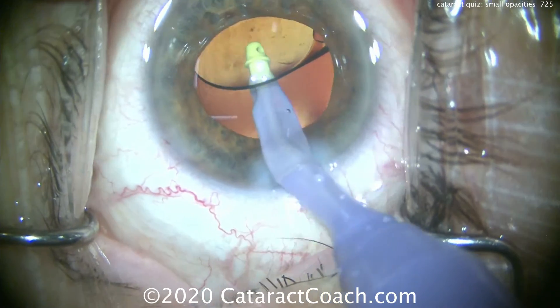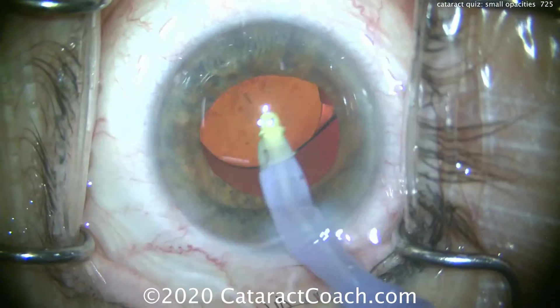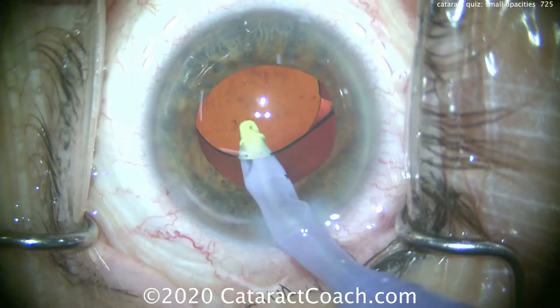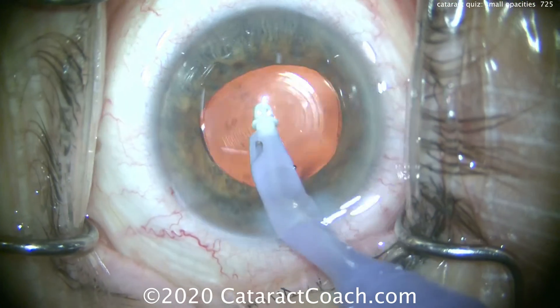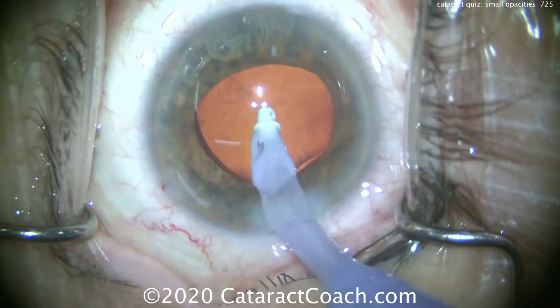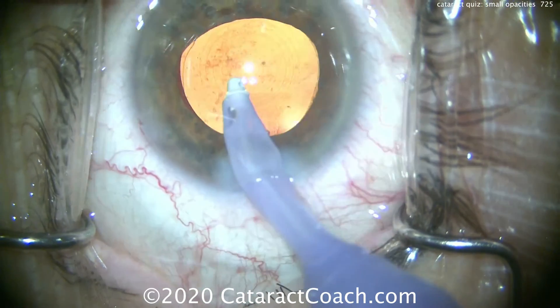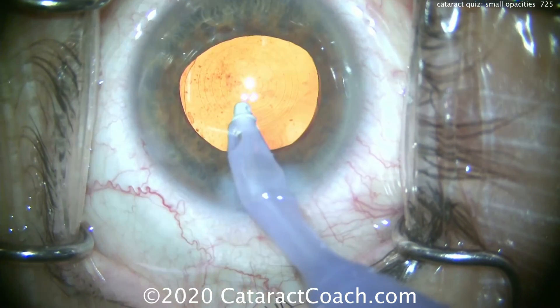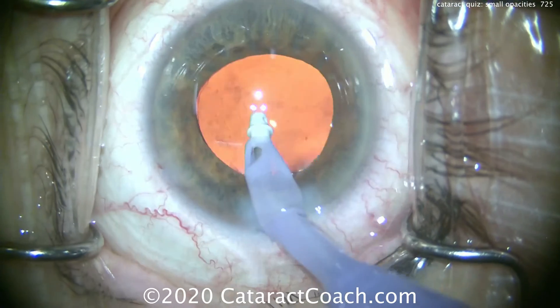Removing all the viscoelastic from underneath the optic and noting that there's good capsular support. If we had poor capsular support, we'd see a lot more wrinkling on the capsular bag and we may see the capsular axis shift — but luckily that's not the case. So we can center the lens up nicely.